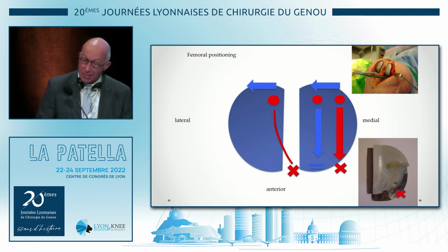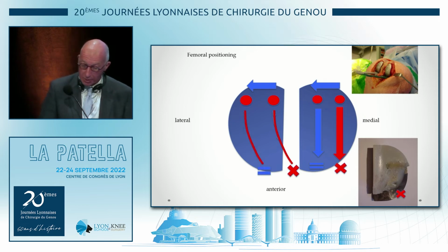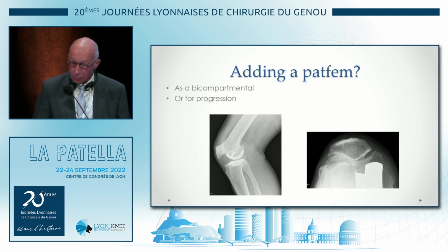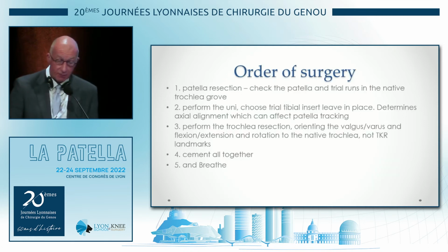So we would actually lateralize the lateral side as much as possible, so we kept it on the polyethylene. So you see the two sides are completely different. If we added a pat-fem at a later date for progression, what I like to do is the patella resection first.